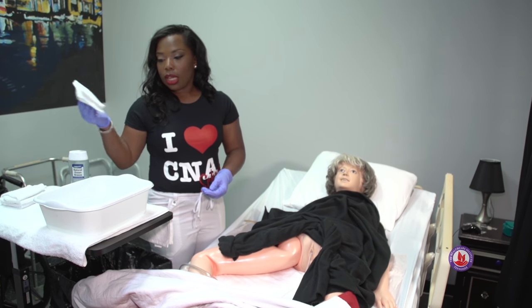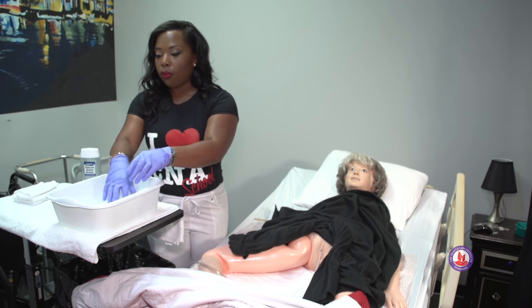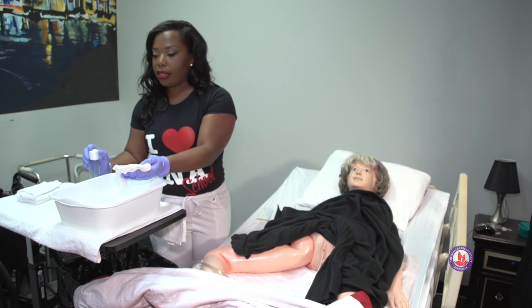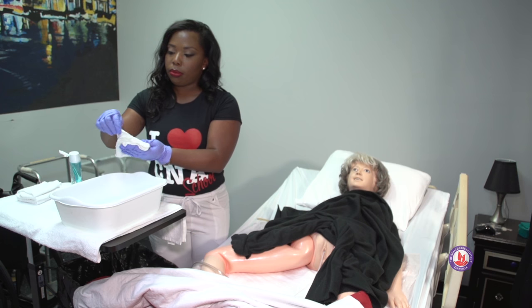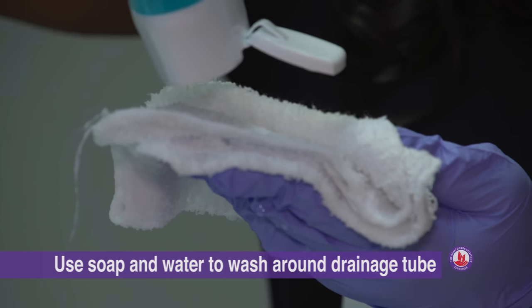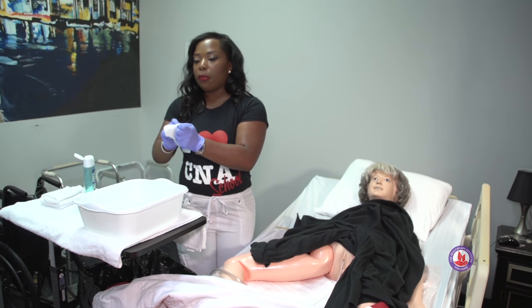Now the first thing we do is we wet our towel. I like to make sure we have it in the four-fold formation, the same way it came off the shelf. We'll wet the towel completely and squeeze it out. No soap goes into the basin — the soap only goes on the towel. So we'll place some soap on each leaf: one, two, three, and four. Form a good lather.